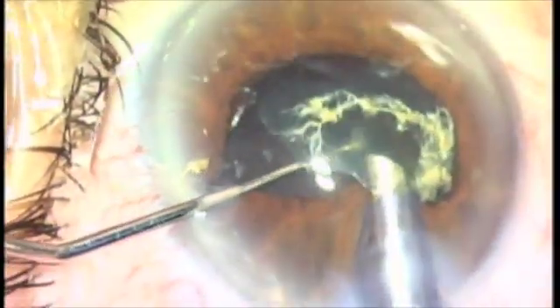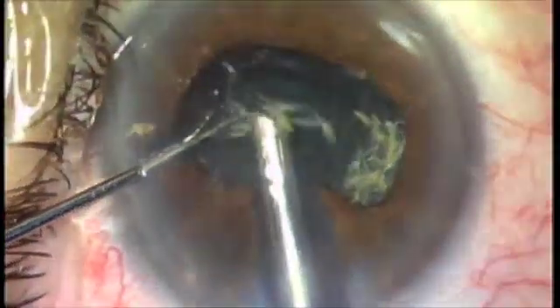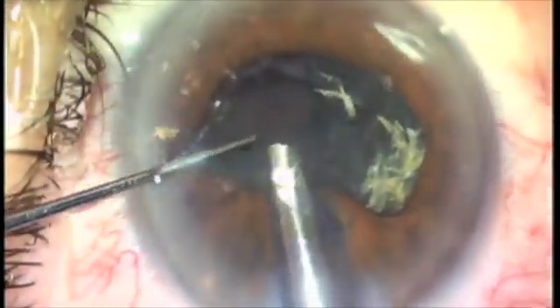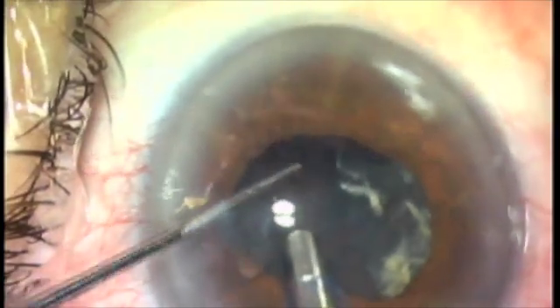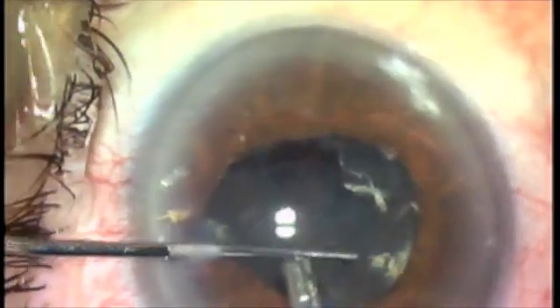The purpose here is to manipulate the nucleus such that what you're phacoing will be near the very center of the pupil. Ergo, you are making a situation where you're in control and you're away from structures that you're going to damage.